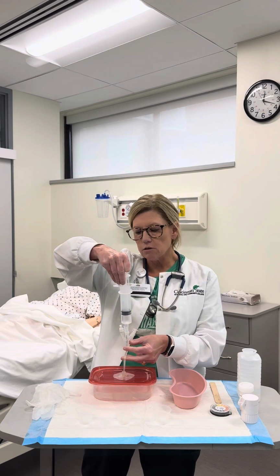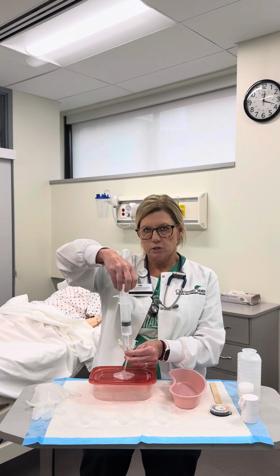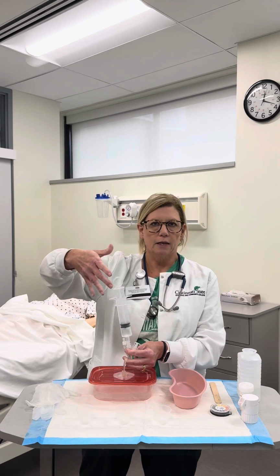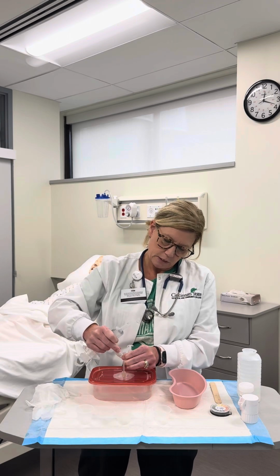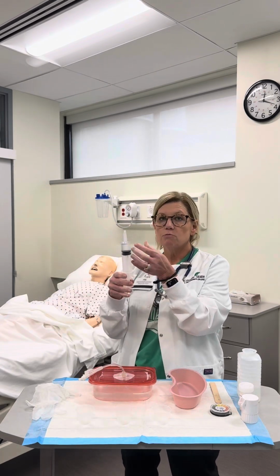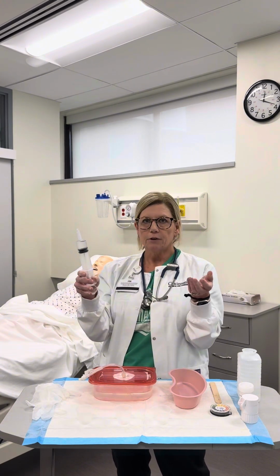So for the skill, we will just tell you when to stop. In real life, when you're pulling back residual, you will start to get resistance and won't be able to pull anymore, and that's when you know that's all you can take out. So for the residual, go ahead and put this cap back on. I want to check to see how much residual I have, and then also the color.